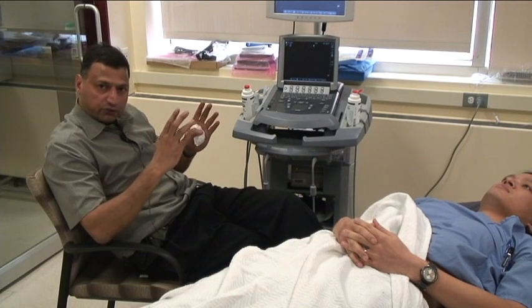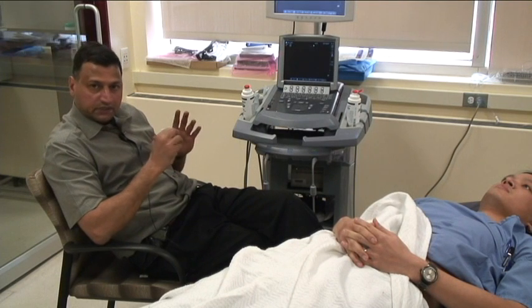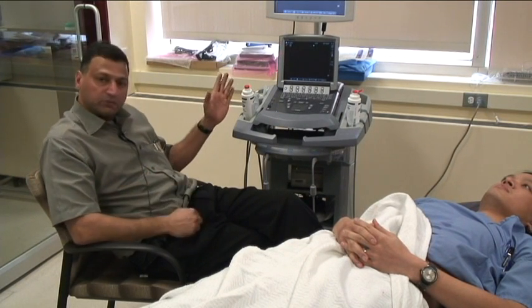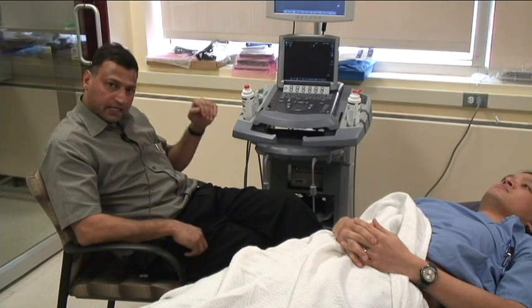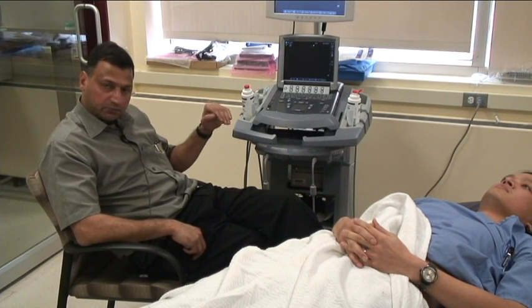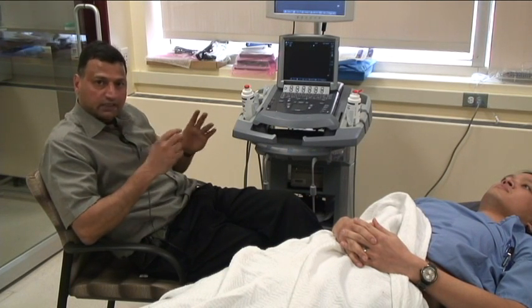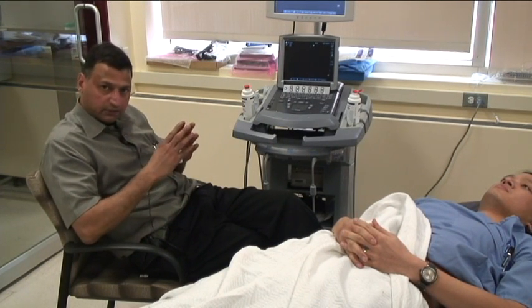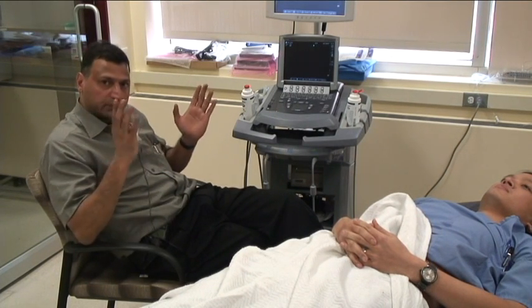There are a lot of numbers thrown out there, but what we are going to be using, number one, is the IVC index, which is the maximum diameter minus the minimum diameter, divided by the maximum diameter, multiplied by 100. If the index is greater than 50, we're going to say that the patient is likely to be fluid responsive.